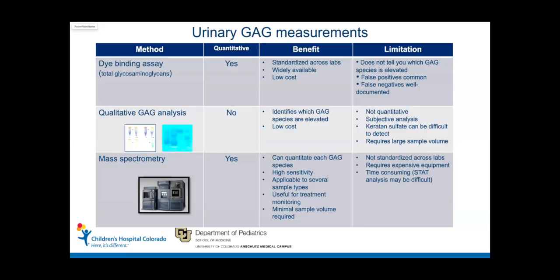We were doing a dye binding assay and we were doing a qualitative GAG assay. And we were trying to put these two tests together, typically in a urine sample from a patient, to try to identify what GAGs were there. And Dr. Munzer already talked about how seeing which GAG species was elevated would help point you in the direction of what condition the patient has. So dermatan and heparan got you a subset of conditions. Just dermatan would get you another set, just keratan and heparan another.